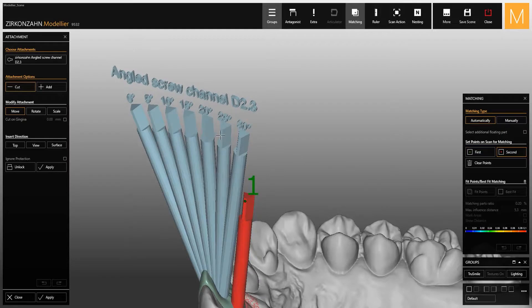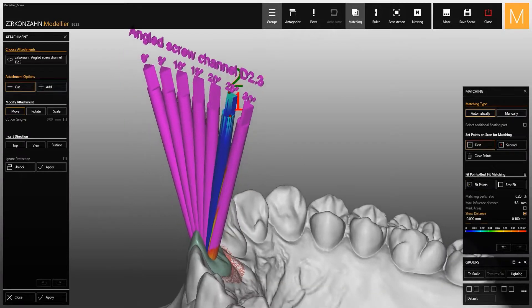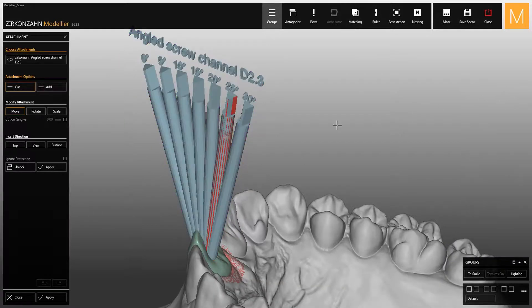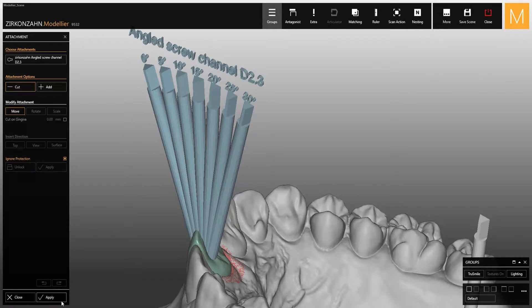Now you can proceed with the matching by selecting the screw channel with the most suitable angle for your restoration. At this point, make sure you activate this option, which allows you to make any changes and ignore all protections such as minimum thickness. Select apply twice — first to make the cut and then to save all the changes made.